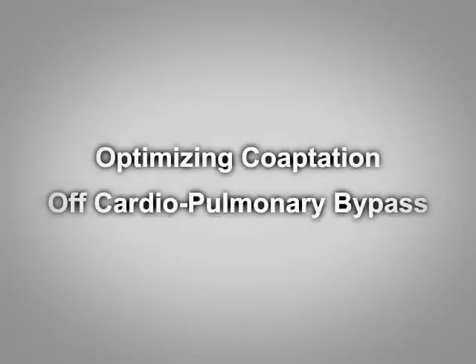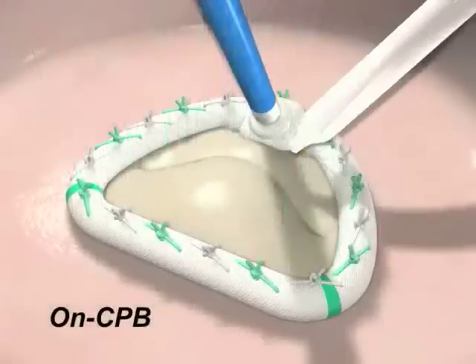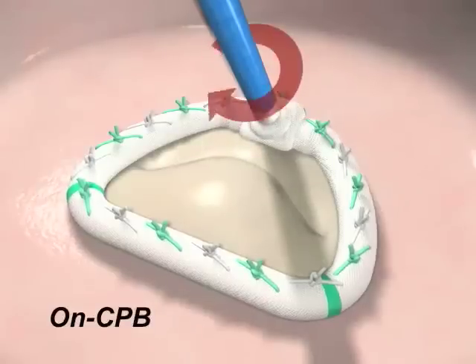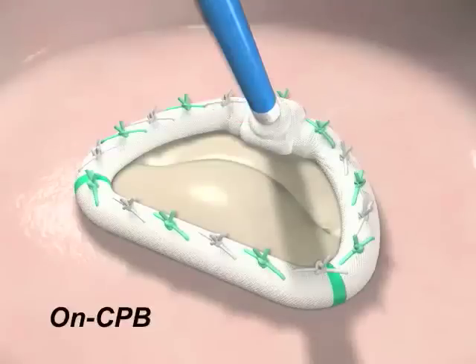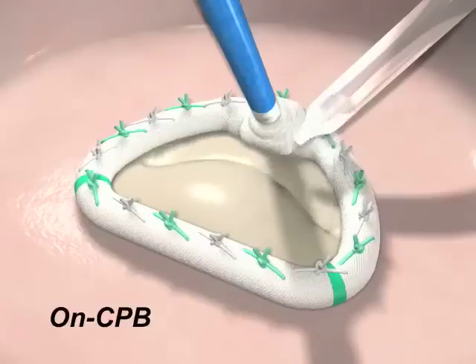Optimizing Coaptation Off Cardiopulmonary Bypass. The adjustable annuloplasty ring is implanted using standard intracardiac techniques and sutured into position on pump. The left ventricle is filled with saline from a bulb syringe to test the competency of the valve. Using the adjustment tool, the surgeon may incrementally reduce the size of the ring until a good line of closure is apparent. A bulb syringe test is again performed to test the competency of the valve.